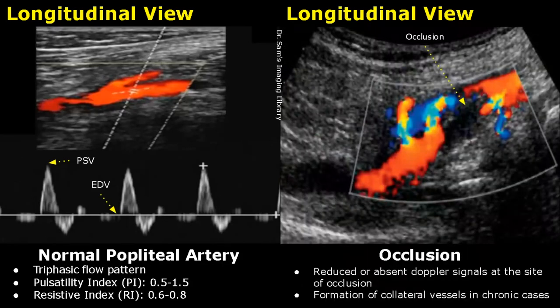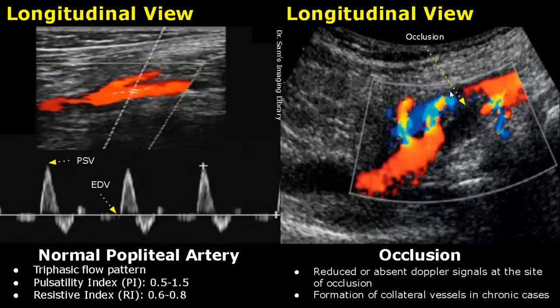Occlusion refers to the total obstruction of a blood vessel. Reduced or absent Doppler signals are seen at the site of occlusion — in this region we do not see any Doppler signal. In chronic cases of occlusion, we will find collateral vessels right next to the site of occlusion.